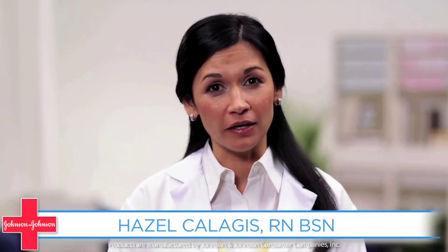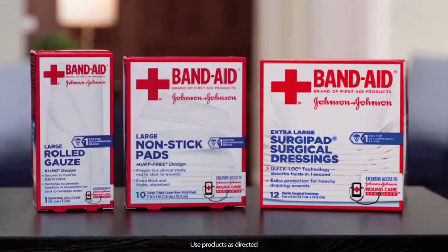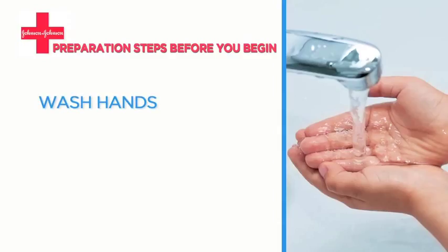Fortunately, there are a variety of products for the different stages of healing, like rolled gauze, non-stick pads, and surgipad.